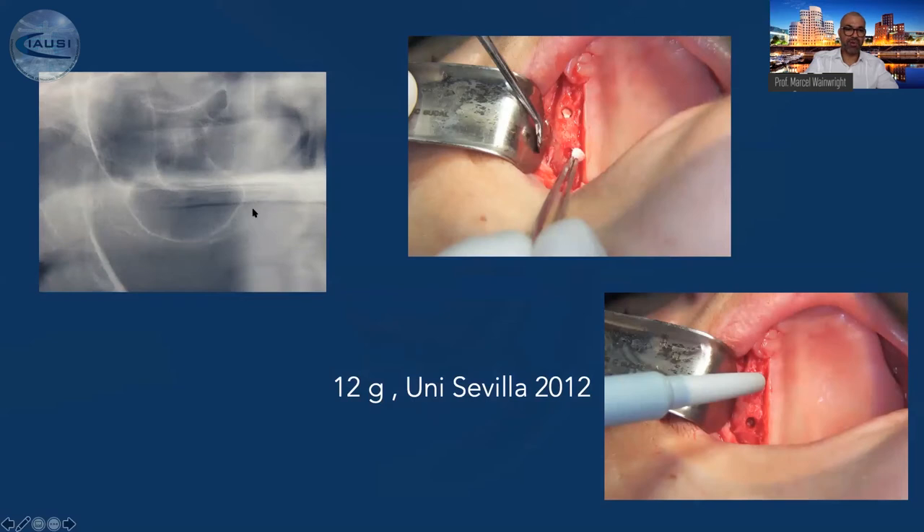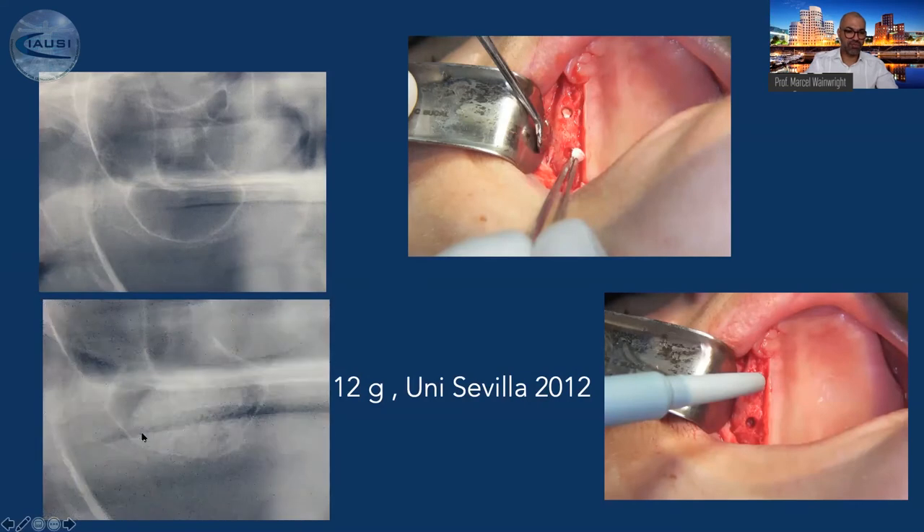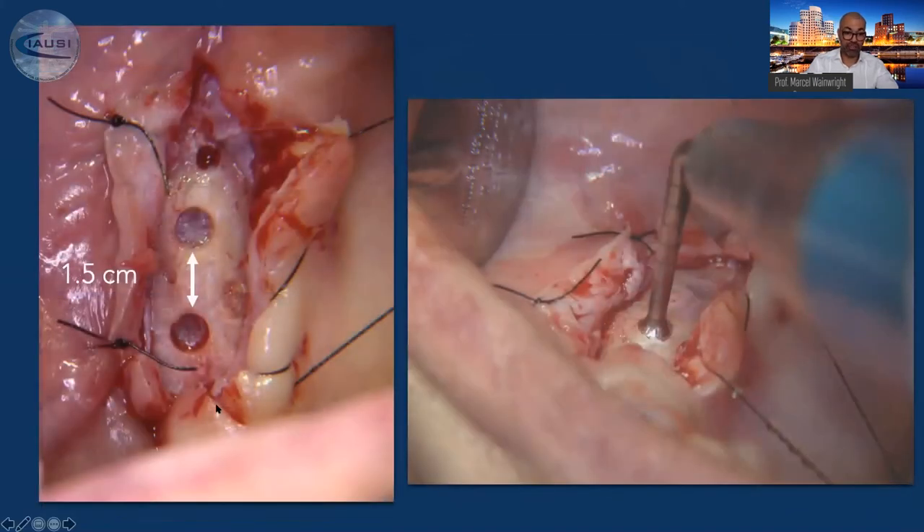Here is a case from 2012 with a very extensive sinus and very little remaining bone above the sinus floor. Once we have this situation, I create two osteotomies with the piezo. Then we first fill with collagen or PRF as a buffer on top to prevent any microtrauma or macrotrauma to the Schneiderian membrane. Then we fill completely. The result shows a very large augmentation of this area — 12 grams of material placed. Of course then you wait a little longer, six to eight months, before implant placement.